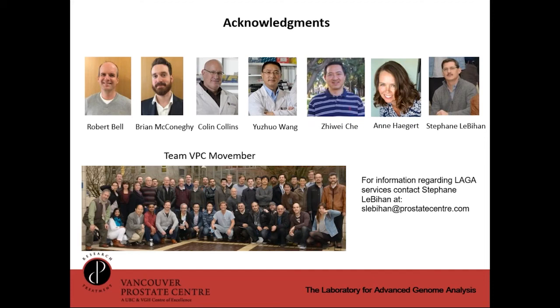Basically that's a more advanced form of the cancer. So the tumor profile is essentially the same, but yeah, you're absolutely right. That's a good eye to pick that out, because there are some new things, and that's the bread and butter of this project, to look for those new things. So that was a good observation to catch. Thanks. Great, thank you so much.